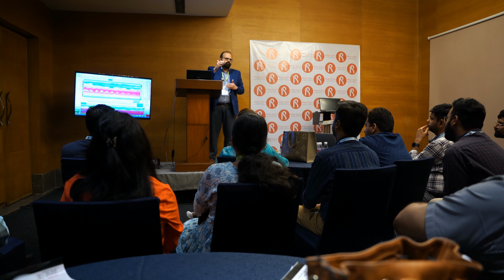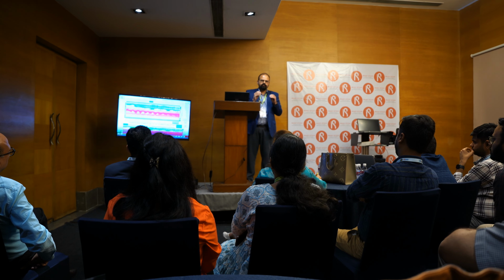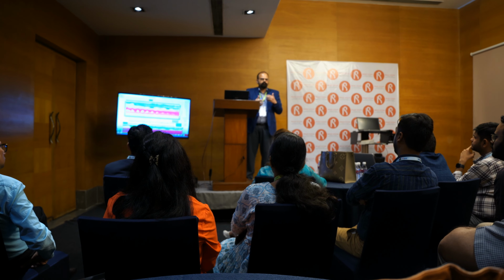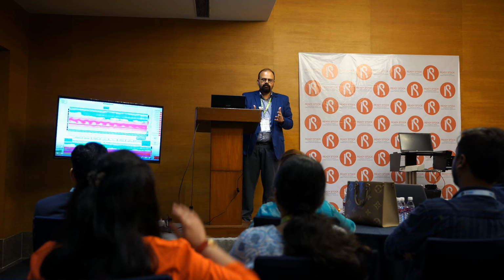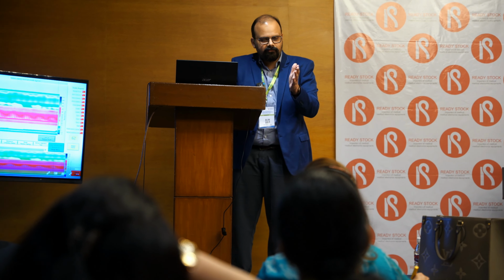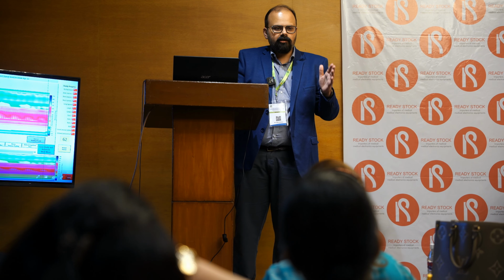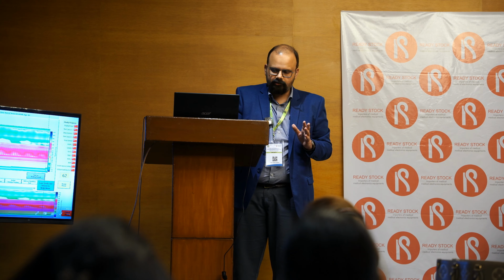If you look into the IAPWG or the London protocol, it tells you once you have placed the catheter, a minimum of 60 seconds you should give to the patient. Sometimes even more than that. If the patient is too anxious, if the patient is a small kid, you wait for a minute, wait for 2 minutes, let things settle down. Sometimes the tone that you get at the first go may not be the true tone of that particular patient. So wait for a minute, wait for 2 minutes if somebody is too anxious, and once you see on the diagram that the patient is stable, you're getting good frequencies, then you start your test.